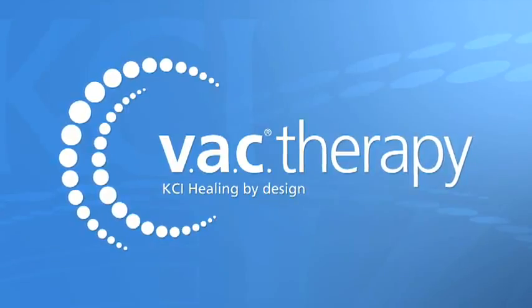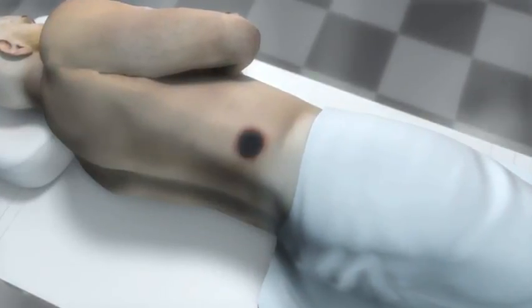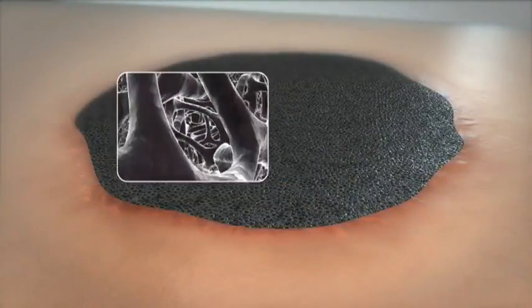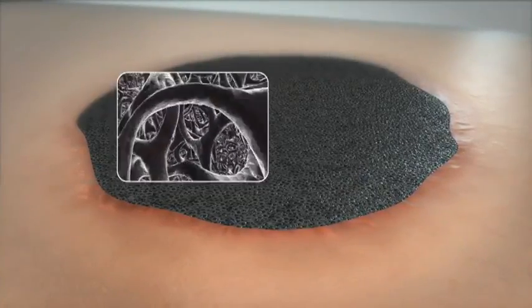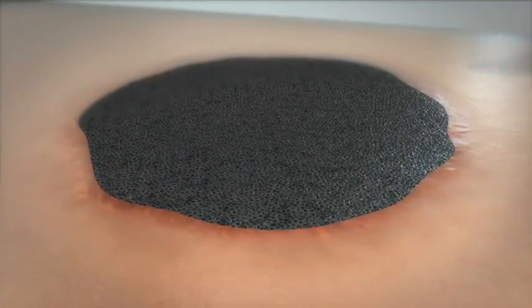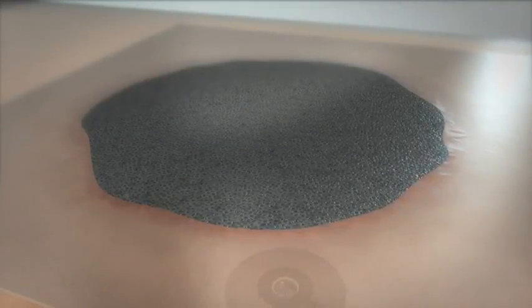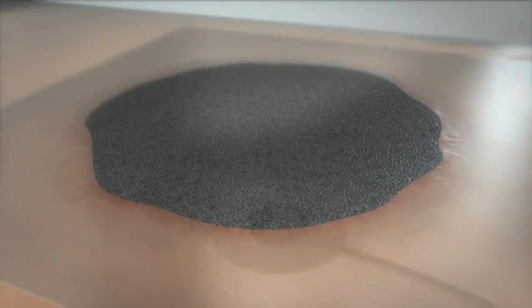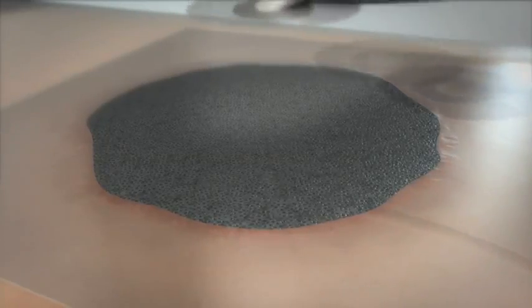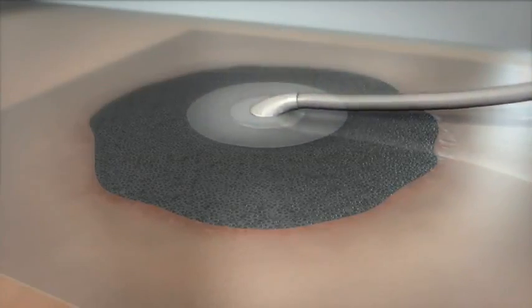in all care settings. When treating a wound using VAC therapy, the KCI proprietary GranuFoam dressing, which is a reticulated open cell foam, is placed directly into the wound bed. A semi-permeable drape is then used to seal the wound, provide a moist wound environment, and protect the wound from external contamination. The proprietary TRAC pad and tubing are then applied to the drape and provide the connection to the therapy unit.